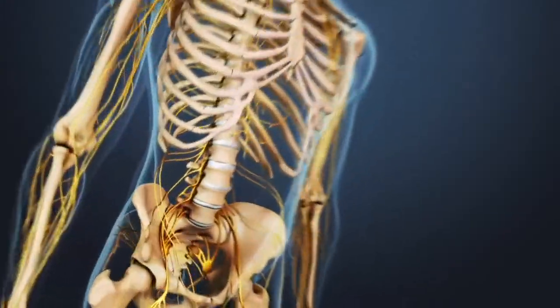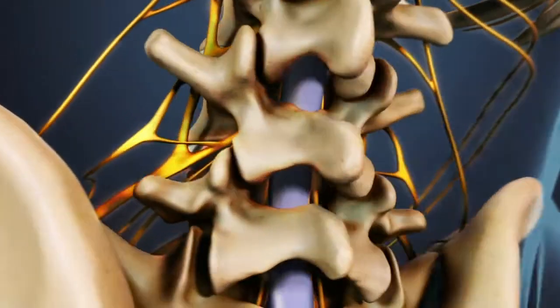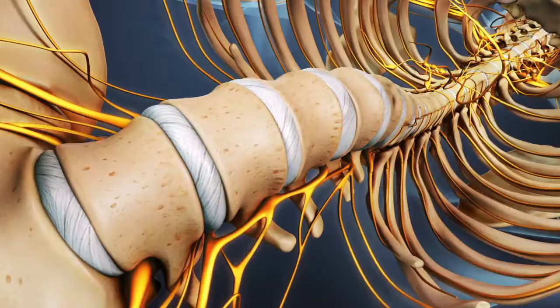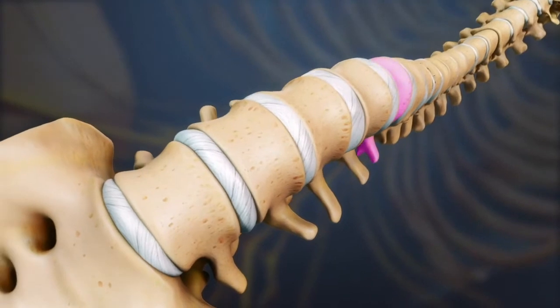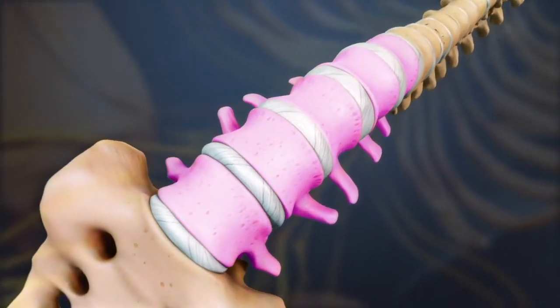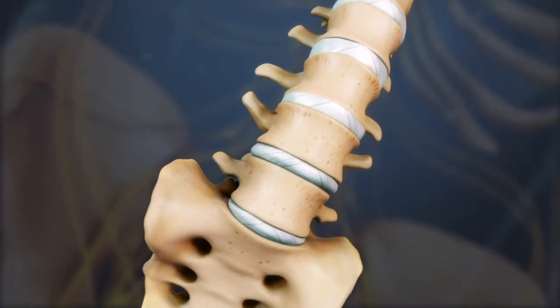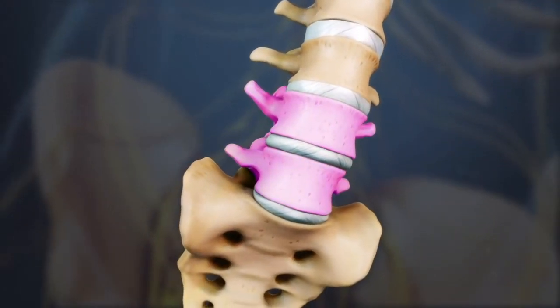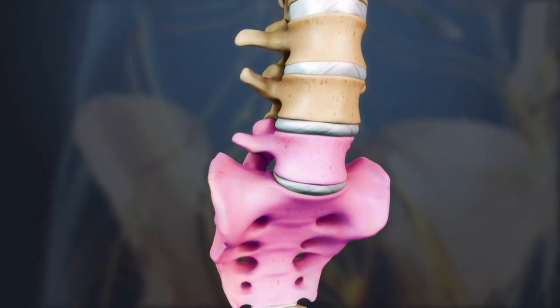Any type of spine fusion joins together or fuses a spinal segment to eliminate the motion at that level of the spine. A lumbar posterolateral gutter fusion is done in the lower back at L1 through L2, through L5 through S1, at the bottom of the spine. It is most commonly done at L4 through L5 or L5 through S1, as these are the segments most likely to degenerate.